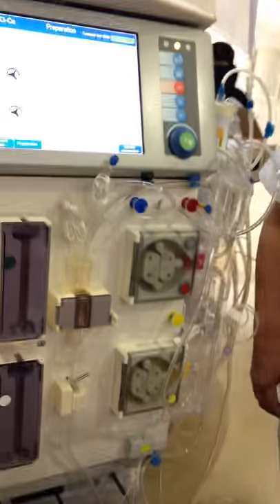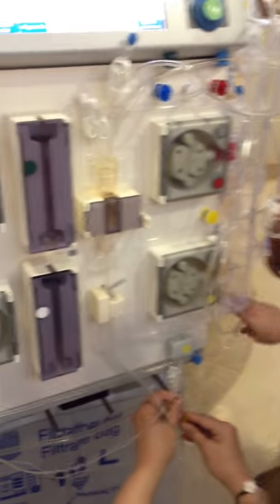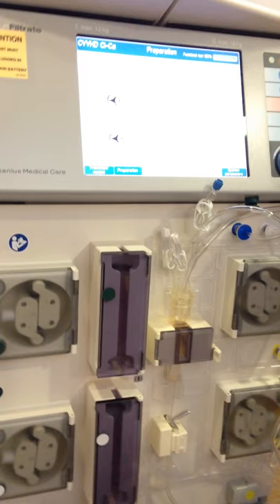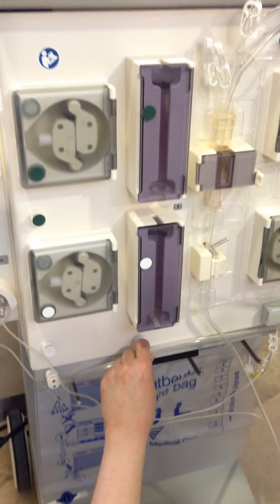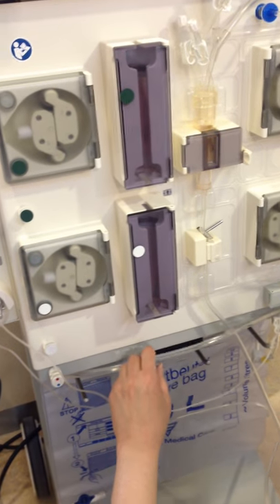Maybe we can attach this one here, or put this in the bag. A laminated copy of this, put in the bag. It should be down. This is the proper way, even with your regular CRRT. Because if this is touching your scale, it creates a weight, and then a balancing error every time you move.